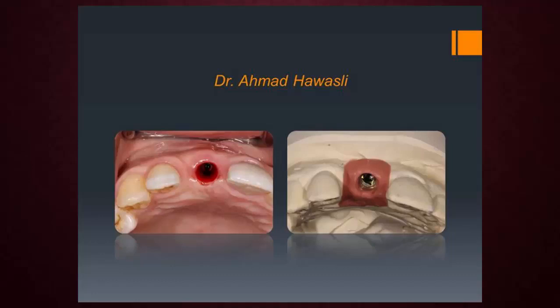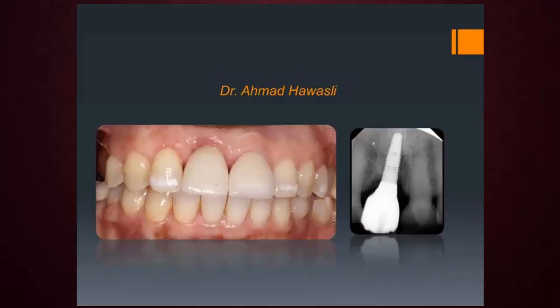So see here on the labial aspect of the implant how the tissue is thick, which is what we like to see. And this is the final restoration.